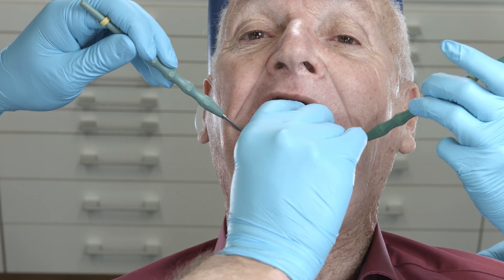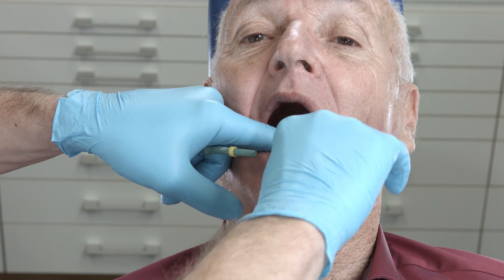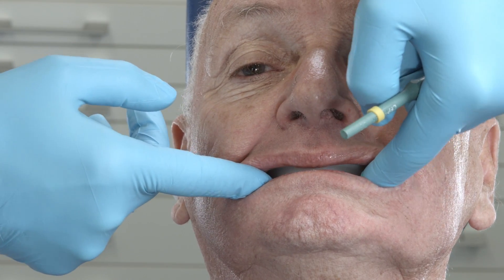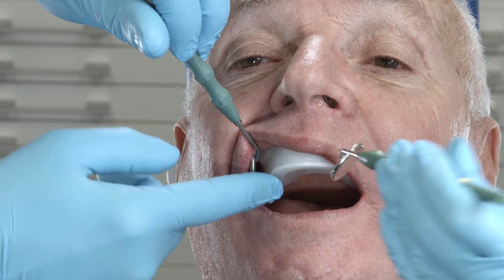Check the 3D bite plates created by the dental lab. Make sure that there is enough space to accommodate the lip and the cheek frenna. When the patient closes his mouth, make sure that the bite plates close in a parallel and flat position. The patient should not feel any pain in the process.